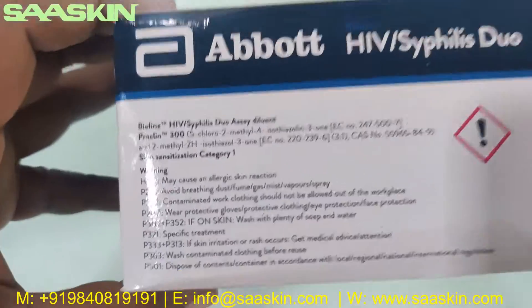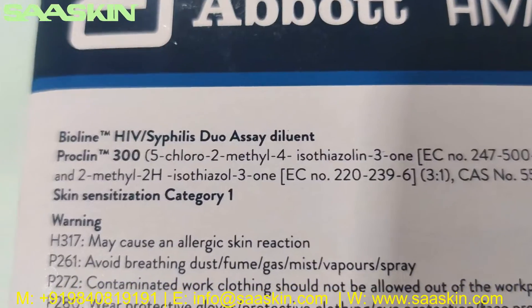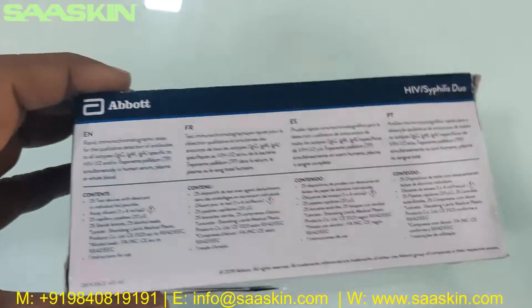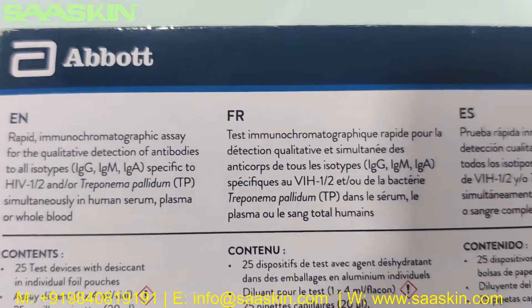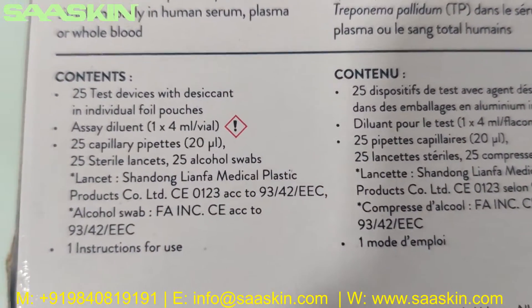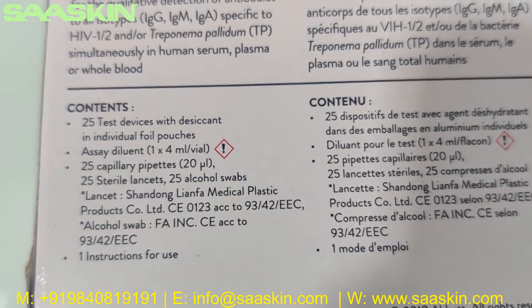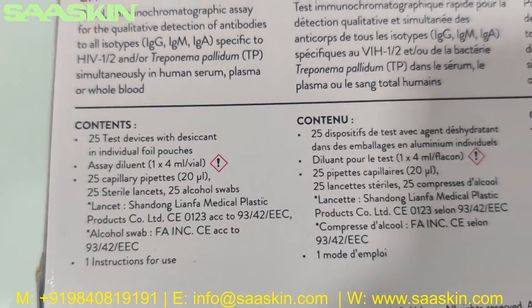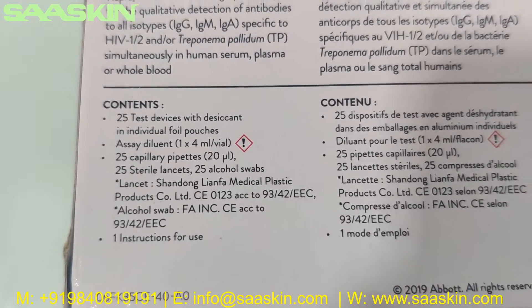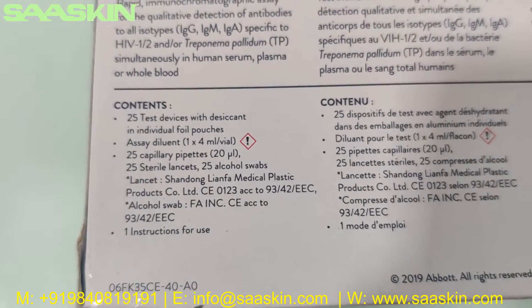Looking at the other side of the box, the contents inside are mentioned here. It says 25 test devices with desiccant in individual foil pouches, and you get an Assay Diluent Buffer, 25 capillary pipettes, 25 sterile lancets, 25 alcohol swabs, and one instruction for use.